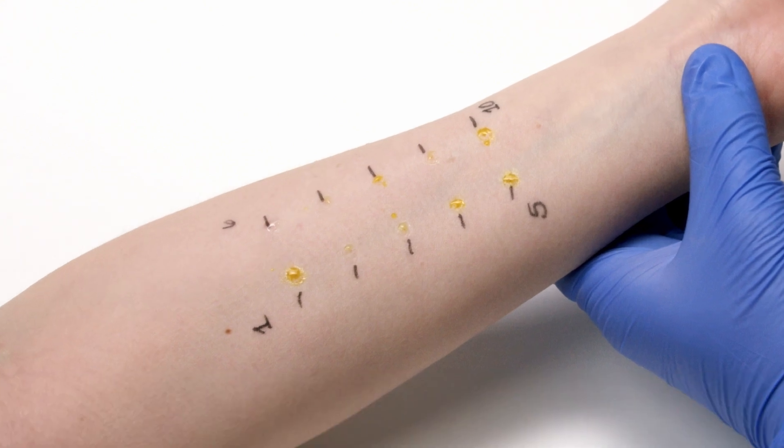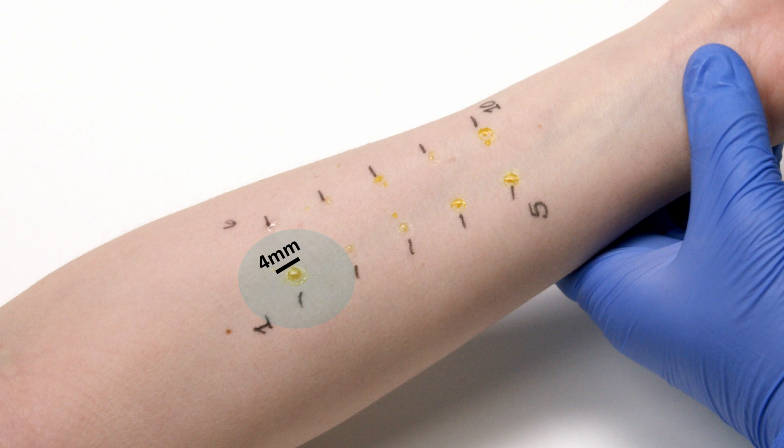Circles created by the depth control guards about 4 mm in diameter will be seen at the test site, indicating the correct amount of pressure was applied.